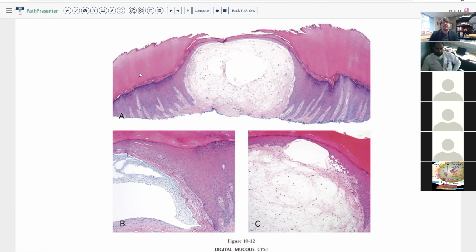One of them is like this, where you actually can see a cystic space with blue mucin filling that little area and making a pool inside. And the cyst is not really a real cyst. It's not lined by anything. But it's got a well-formed fibrous wall that's around it, just with no epithelial lining, okay? So that's one pattern.